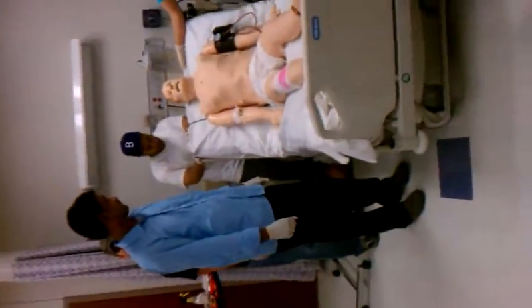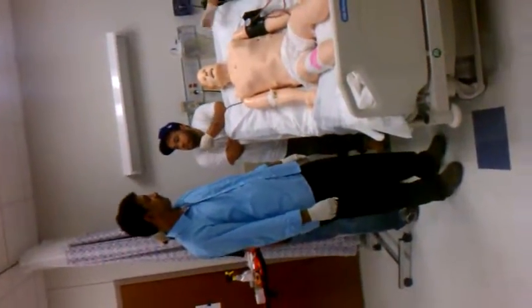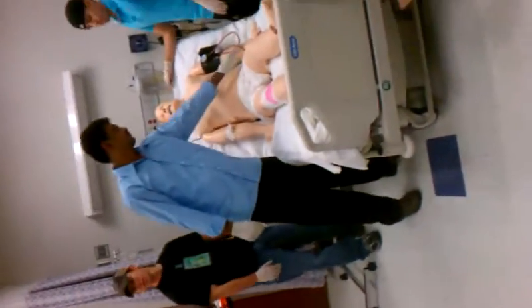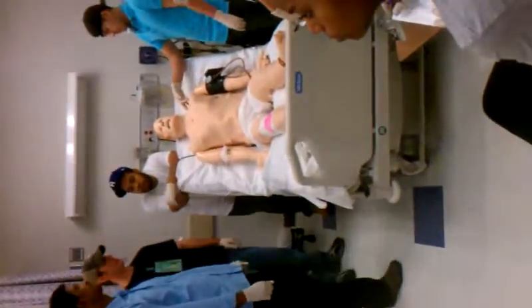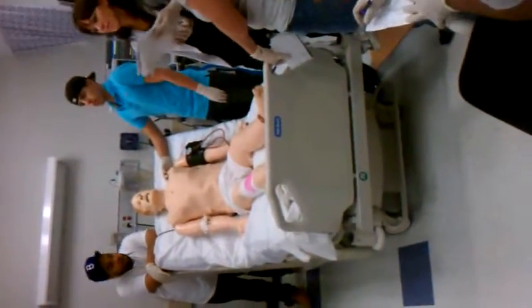Like I say, some of these sims are older in what they're looking at, because you won't find RSBIs on these most of the time, especially on some of the older ones. This one's only a couple years old, but even still, they can do all of that. So they went with a cool mist, where I'd probably just put him on a Venturi mask. You're right.